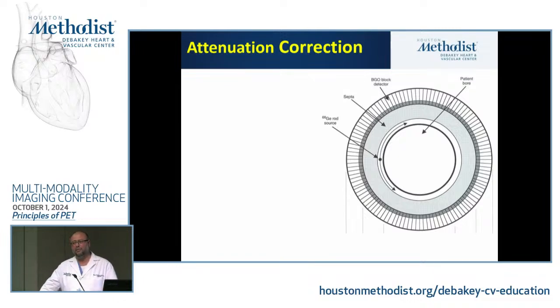The only time we look at these is when we're doing infection imaging or FDG imaging, and we're looking at something that has metal, or dense calcification. That's the only time. But for perfusion imaging, attenuation correction is a must. Your PET images are always attenuation corrected. Full stop. This is non-negotiable. You're not going to look at non-attenuation corrected images.